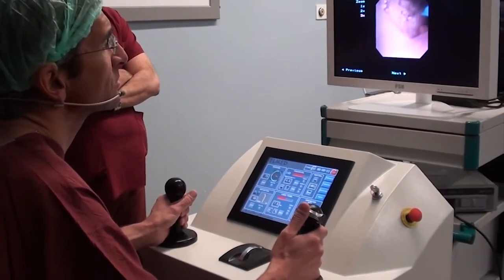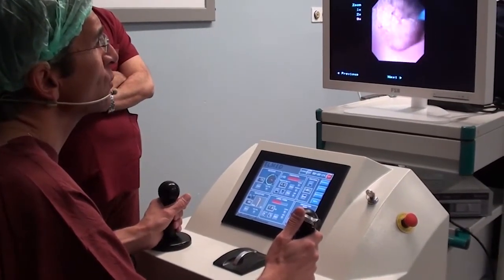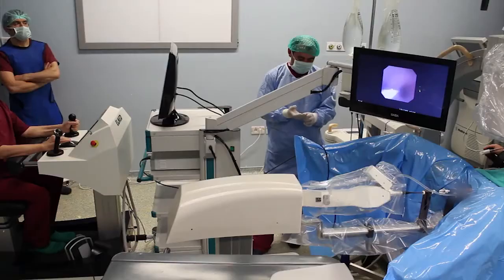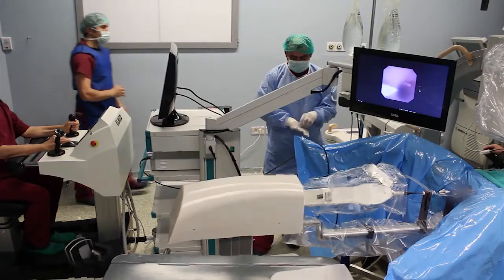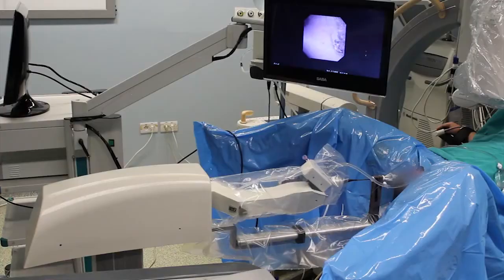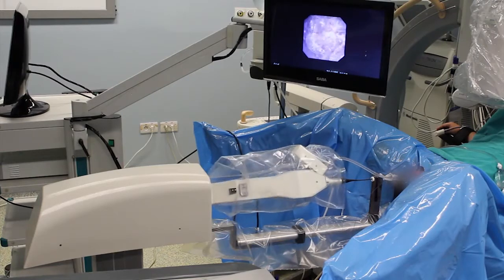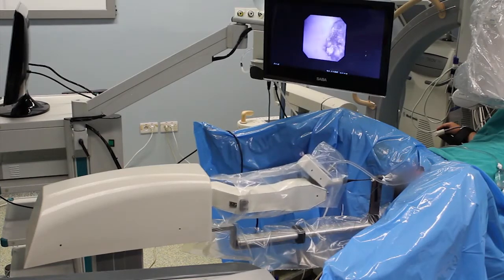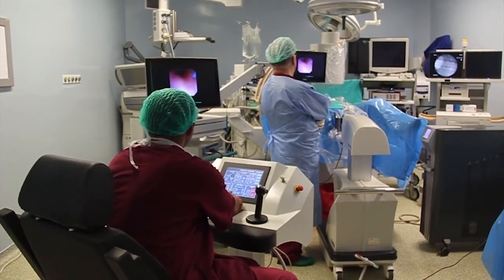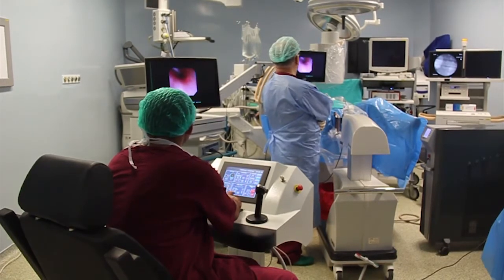We aim to use this robotic manipulator to pulverize the stone precisely and to treat even larger renal calculi, all the while the surgeon sits in the ergonomic chair out of radiation danger. The Avicina Roboflex consists of the surgeon's console and the manipulator of the flexible ureteroscope.